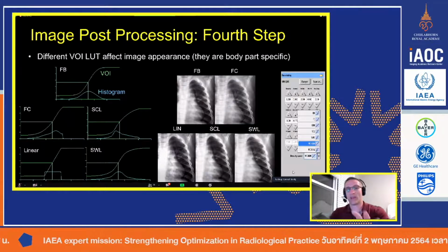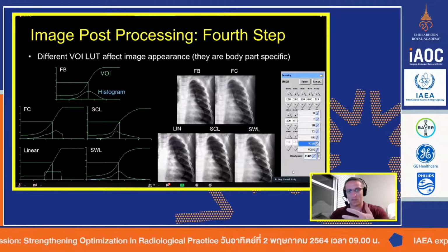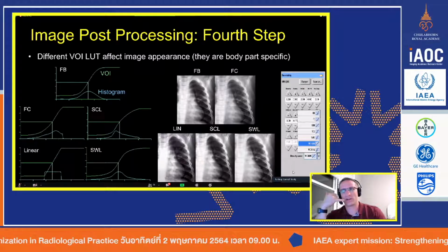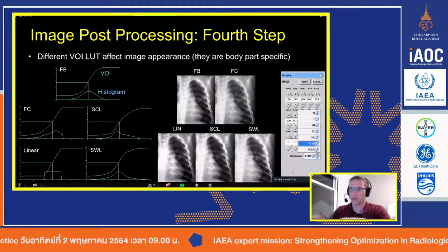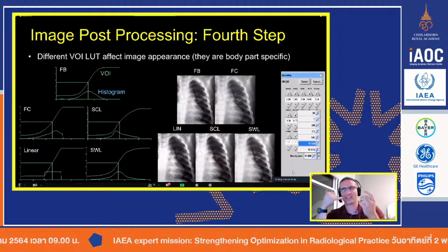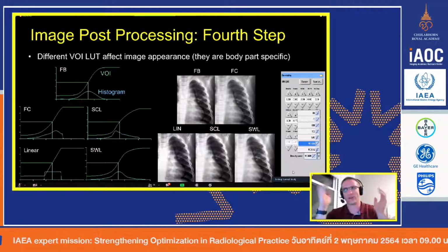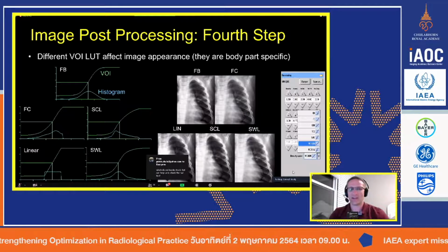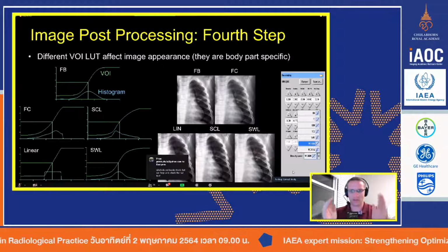For the longest time at our institution, we would acquire the image, and it didn't look so good. So the technologist would call the radiologist and send the image to PACS. The radiologist would have to stop what they're doing, pull up the image, look at it, and say, no, that doesn't look right. So they would process it and resend it. And it was so annoying. The poor radiologist, all through the day, kept getting stopped and interrupted. So we finally said, no. What you need to do as a technologist, you're smart, intelligent people.